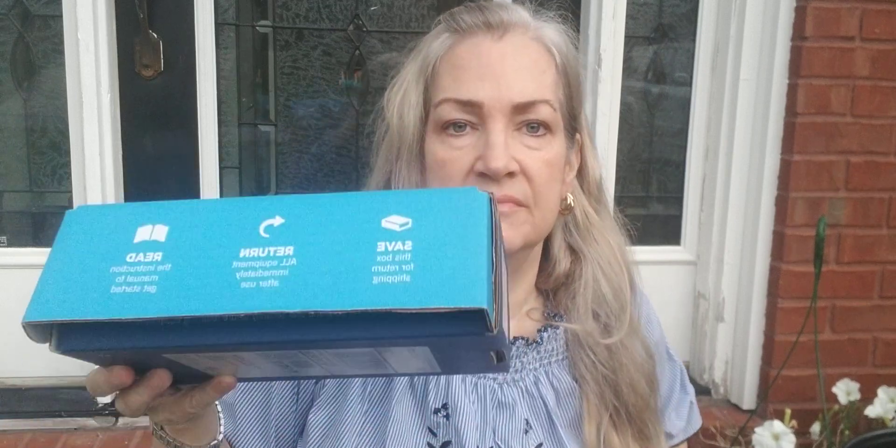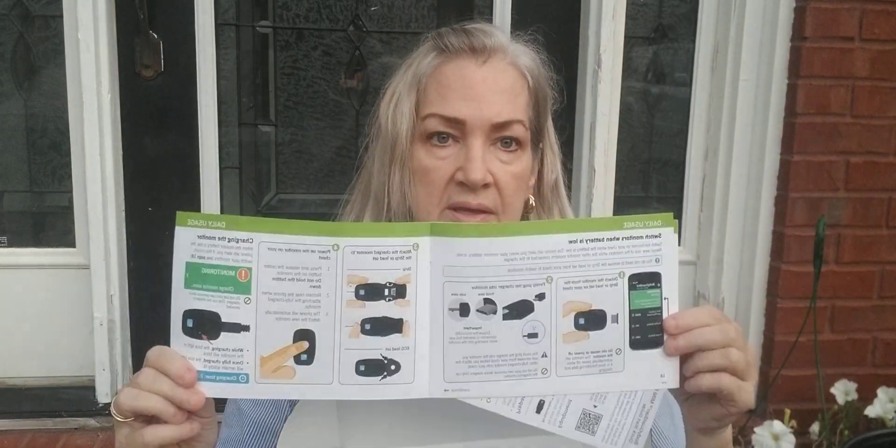First of all, it comes in a little box like this. Everything that you need is in here except that I am using a fanny pack — I nested a whole part of this in it. So I've got a little fanny pack that I use. Let's open the box up and I'll show you what's inside. It comes with some extra things that you need to put your monitor on and off, and it comes with a nice little instruction booklet.